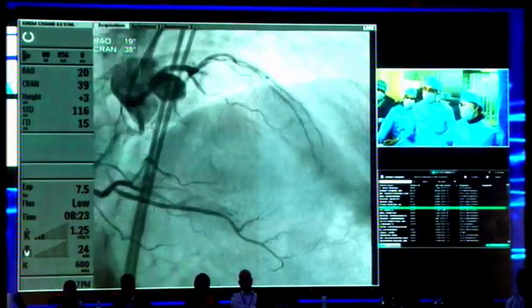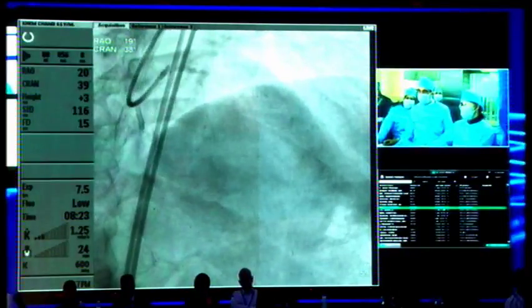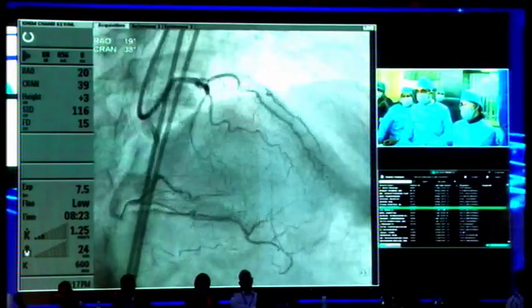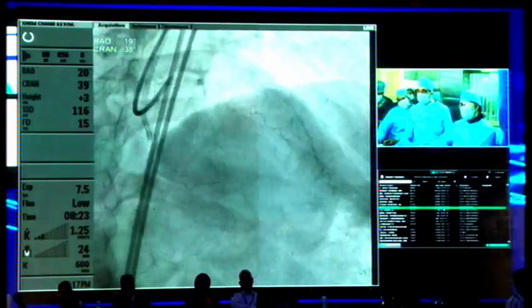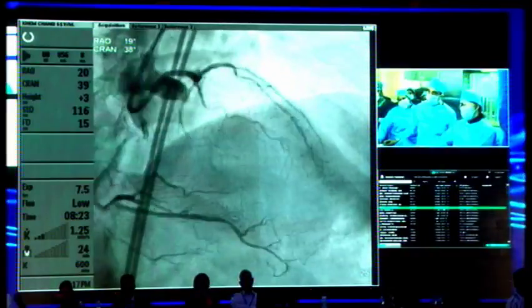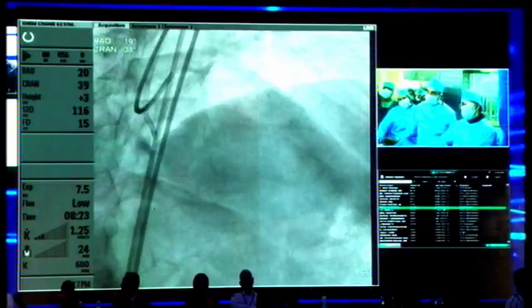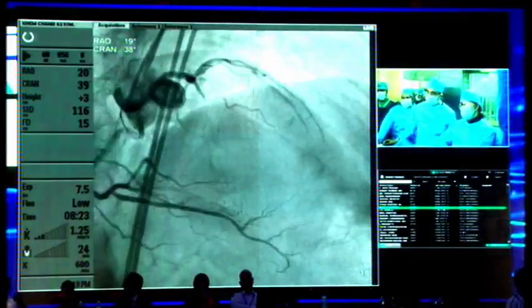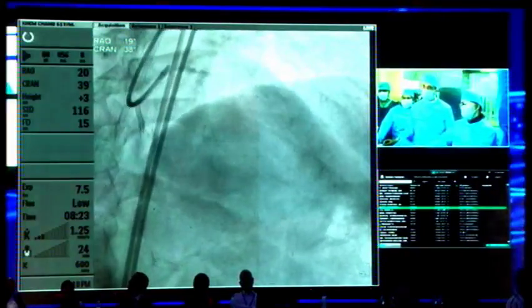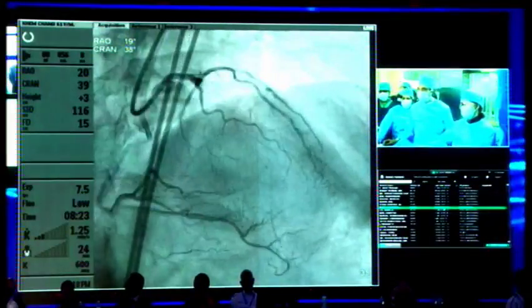So the initial diagnostic angio shows that the retrograde collaterals are up to the distal part of the stent, but I'm not sure today because the visualization is very poor. So overall, what we are dealing with today is a proximal cap that is not so ambiguous. Lesion length is probably about 20 millimeter. And the distal landing zone is a little bit poorly visualized. And a collateral vessel is probably present from the distal RCA to the LAD. So those are the situation.